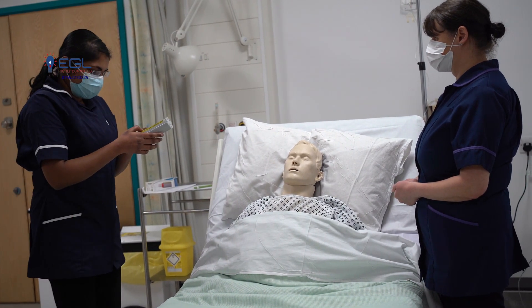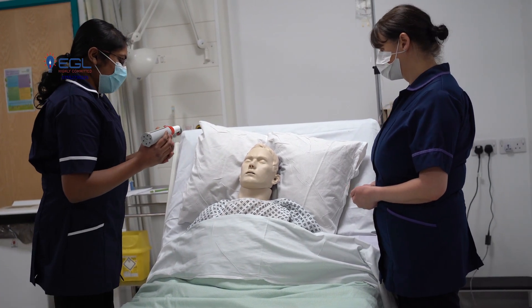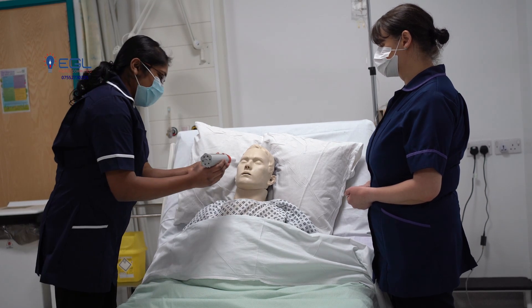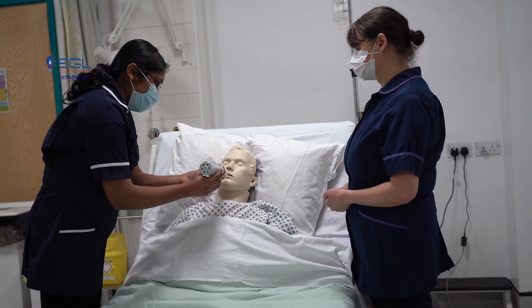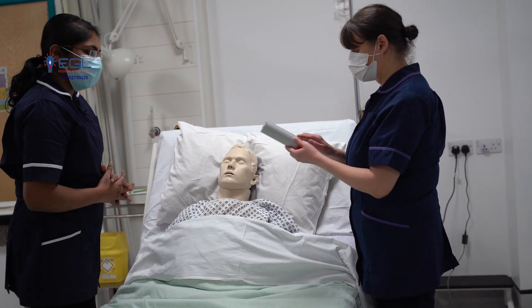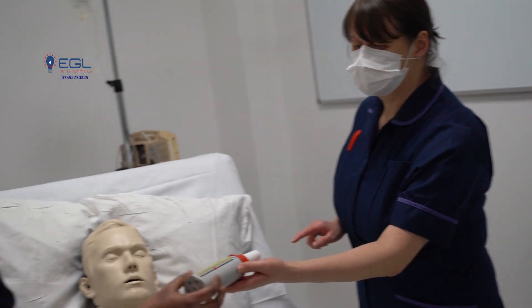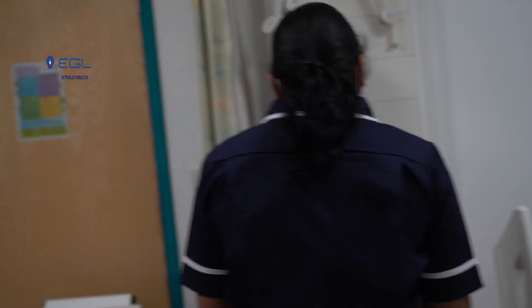Shall we do the second attempt? Yes. Okay, do the same procedure. You can take a deep breath through your mouth and hold it for no longer than 2 seconds. Seal the mouthpiece around your lips. You can exhale forcefully. Thank you very much. Your second reading is 440.